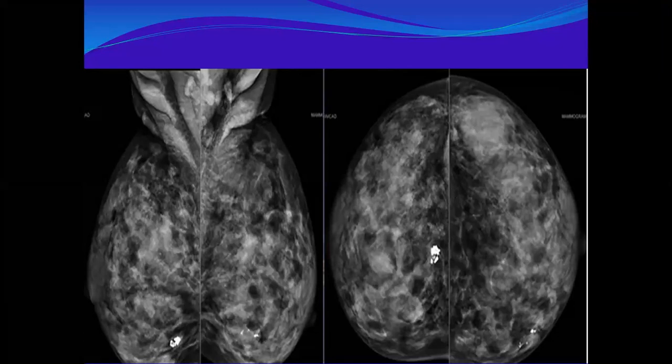Where? Start by laterality, right, left, then describe further. In the right breast. You are talking about these calcifications? No, outer. There is outer here. No. Inner central. Here. Yes. It's okay. Accept it, this lesion. However, it cannot be well seen, not appreciated on the other side. If I tell you there is normality in the other side.